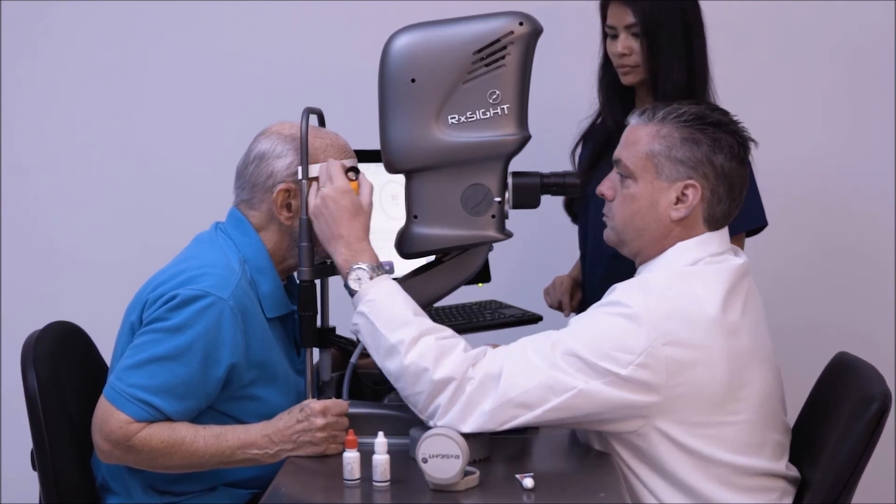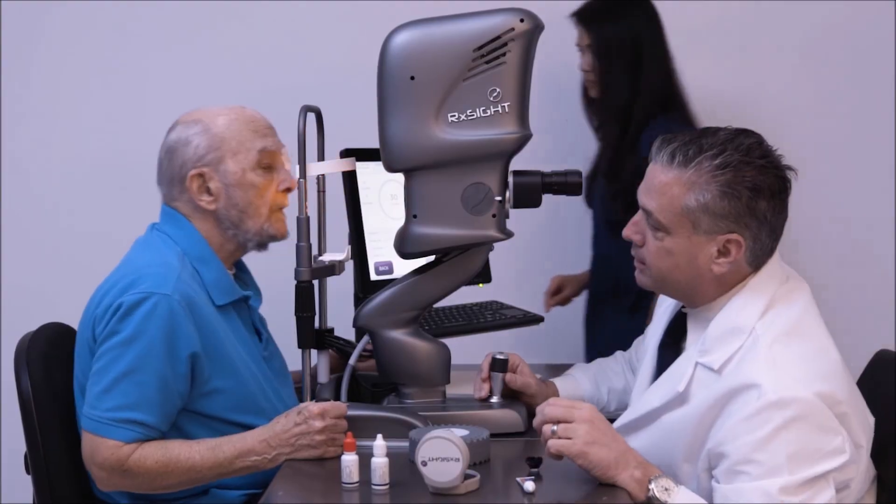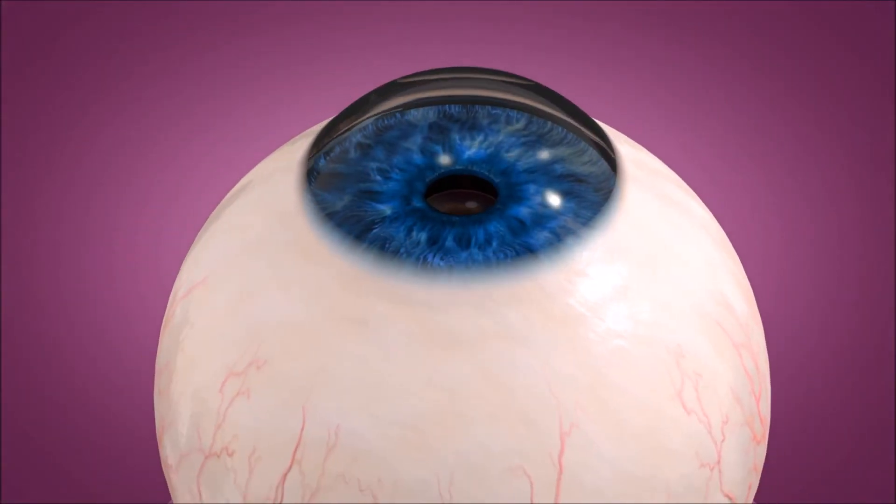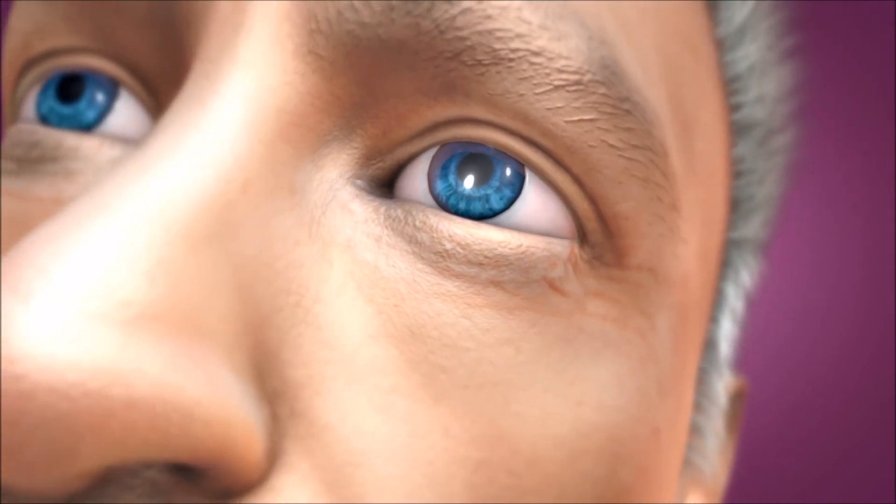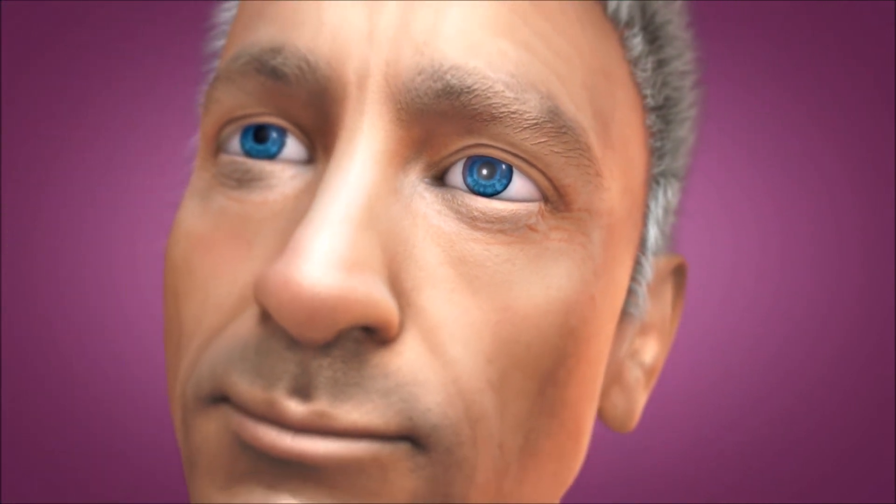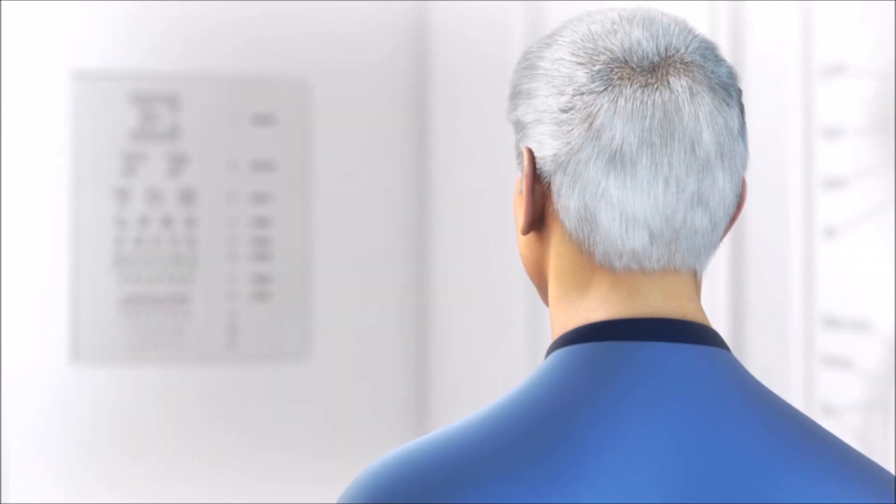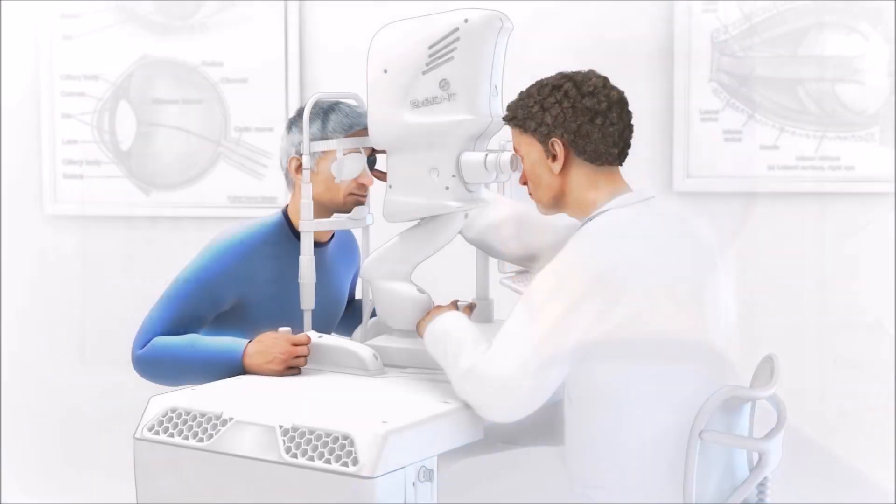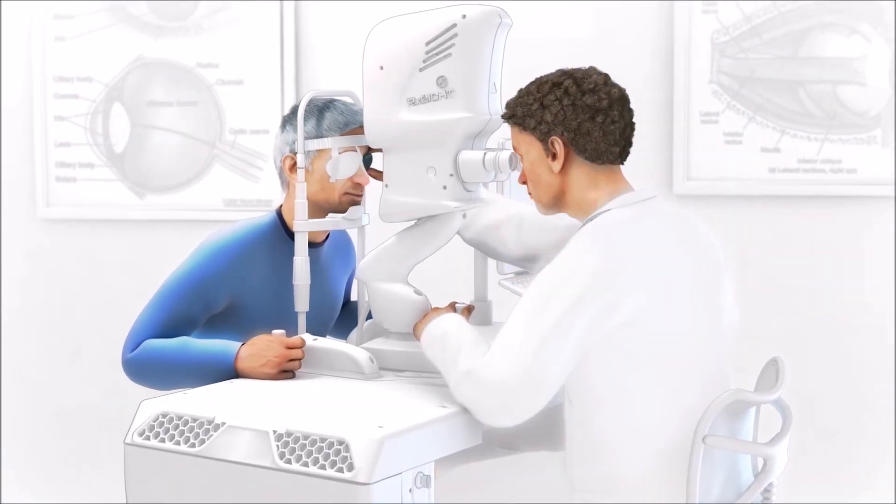No further adjustments or changes to the now customized lens can be performed. The RxLAL can provide significantly better visual outcomes due to the ability to fine-tune the lens after implantation. For doctors, this means increased confidence in hitting refractive targets and improved patient satisfaction. For patients, this means an increased likelihood of achieving the best possible vision.